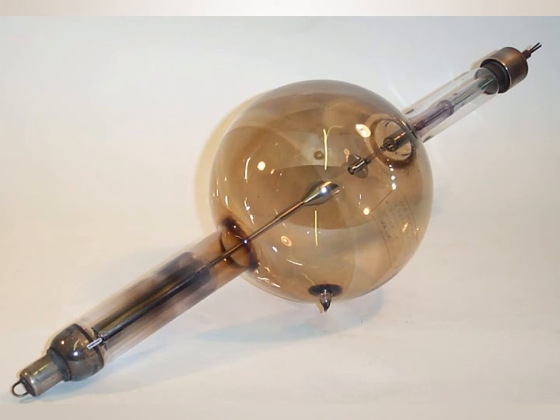The X-ray tube we will cover in this presentation was developed by Dr. William Coolidge in 1913 and is called the Coolidge hot cathode X-ray tube. This is a picture of one of the first Coolidge hot cathode X-ray tubes marketed by GE.